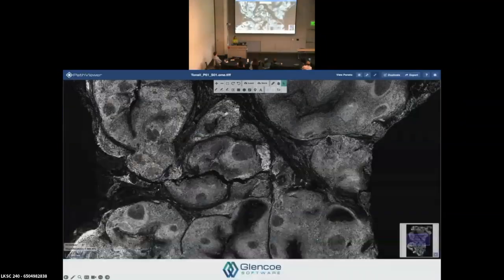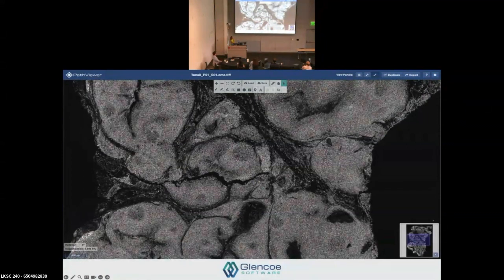So let's think about how we actually look at these image analysis results. I showed you some examples earlier from PathViewer. We had a nice nuclear segmentation overlaid with the original image. And we found that we had a problem with these very large images, millions of objects. It was fine to visualize those objects, but when you're all the way zoomed out on this piece of tissue, there are some interesting spatial patterns that we can already appreciate with this image. We don't have to zoom all the way in to see where there are some interesting patterns in the tissue.